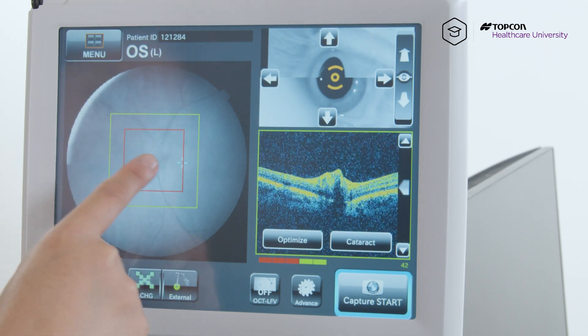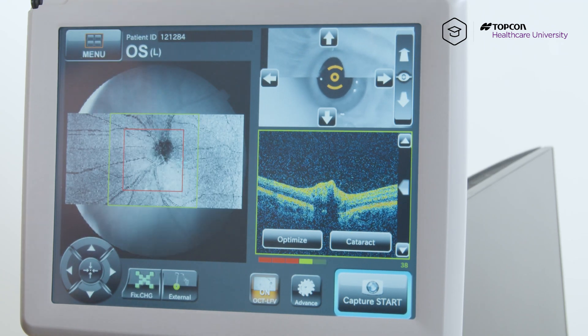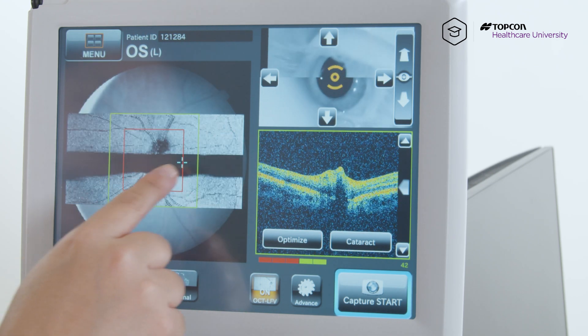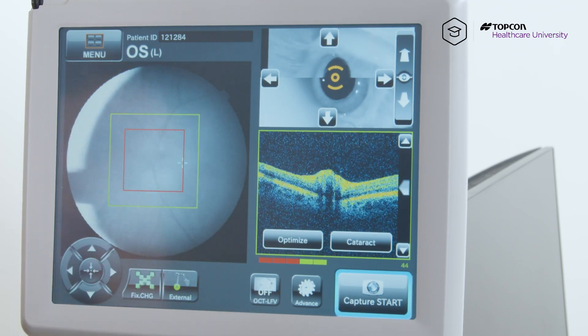The goal here is to make sure that optic disc is in the red box. So if you have a hard time seeing it, just hit this button here — OCT LFV, which stands for Live Fundus View. If you hit it on, you'll see a black and white, high contrast image of the optic disc, so that way it'll give you a better way of finding it on the image here.